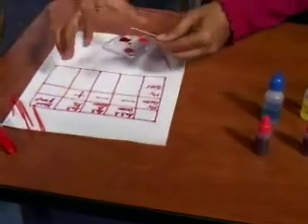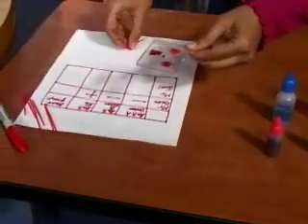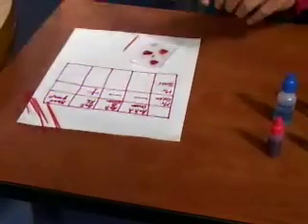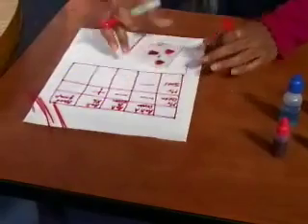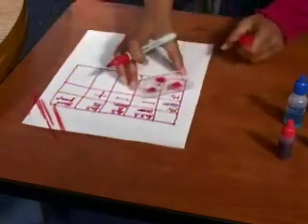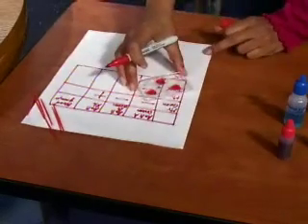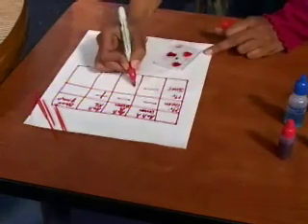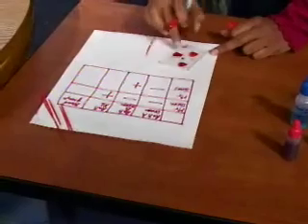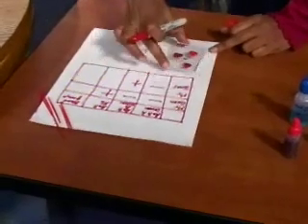Again, from a distance you may not be able to see, but with the anti-A, there was no agglutination. With the B, there is a slight amount of agglutination. It appears opaque. I can't see the writing that I've done over here. So there was agglutination with the anti-B serum, which means it found the antigen. And again, there was no agglutination with the anti-RH.